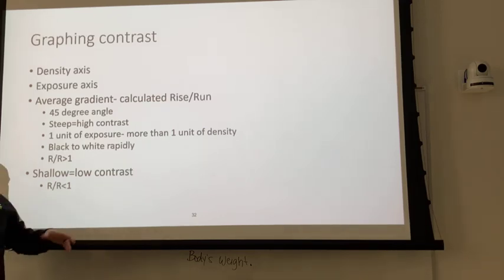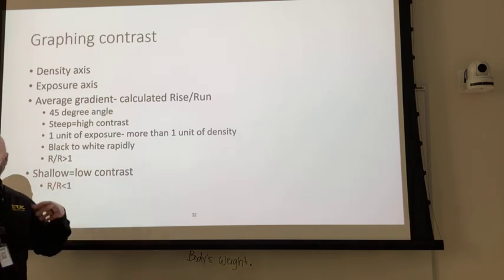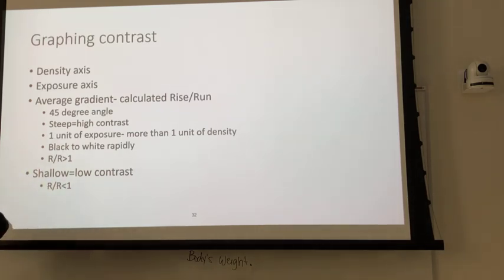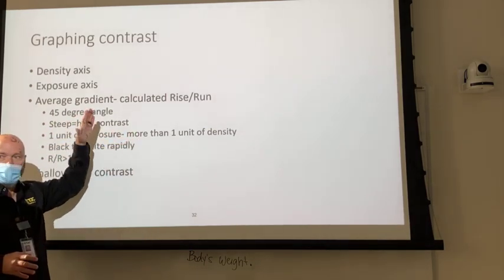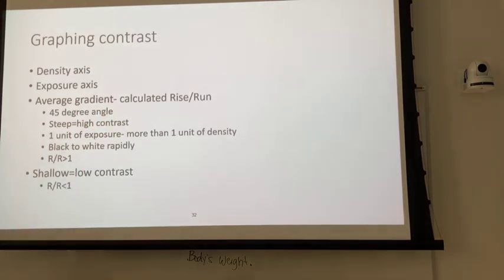Our image receptors and our processing is a little bit more sensitive than that, so that whenever we double our image receptor exposure, we get an increase in our perceived exposure at a greater rate. In other words, if you double your exposure to the image receptor, the density or your S number, your index number, should indicate that you got a greater than doubling response. Okay, so we're never going to have a H&D curve that the straight line portion is a 45-degree angle. It's going to be more vertical than that. It's going to appear higher contrast than that.